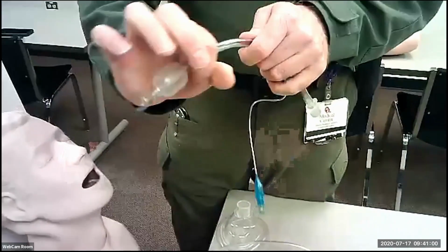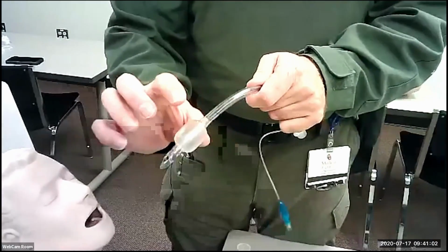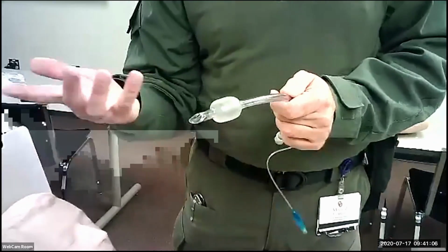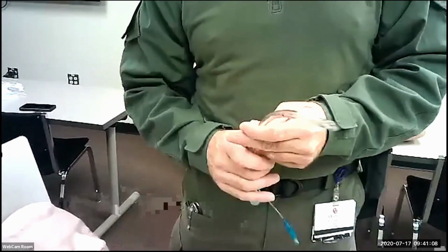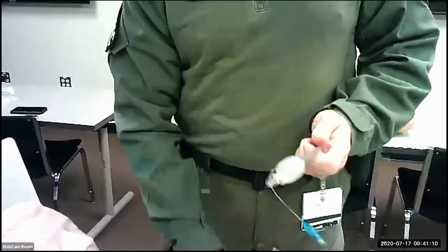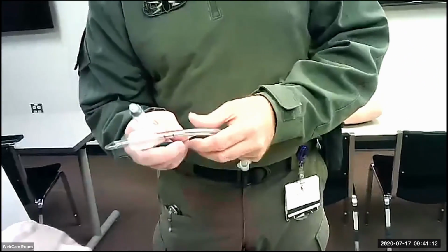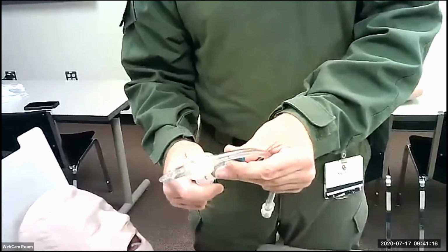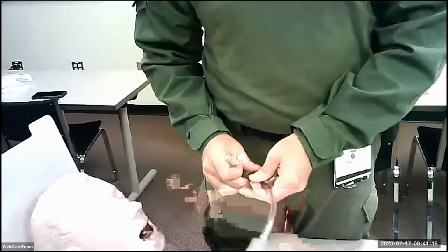We can suction this out from here, but if it gets past this and into their lungs, we've just introduced foreign stuff, stomach contents, everything else into your lungs. It's called aspiration pneumonia, and you'll spend a while in ICU if you ever get out. Stomach contents and lung tissue don't go real well together.